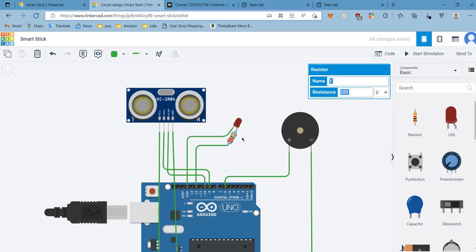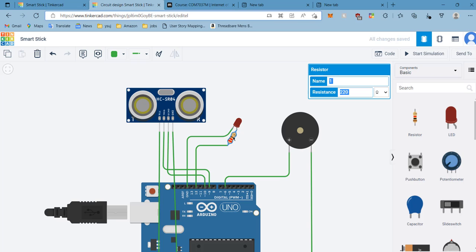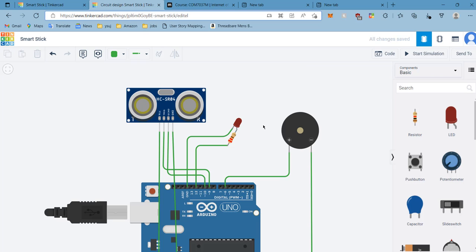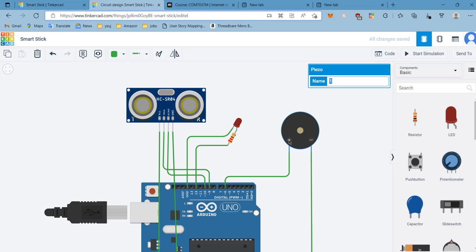The resistor is there so that if the current flowing to the LED is high, the LED won't get damaged. To prevent that, the excess current will be absorbed by the resistor. The resistance for the resistor is 220 ohms in order to increase the lifespan of the LED.